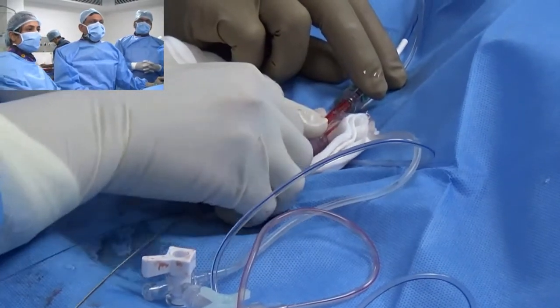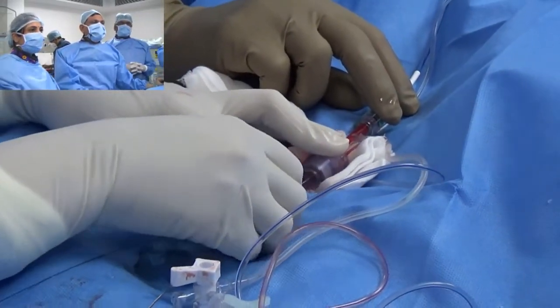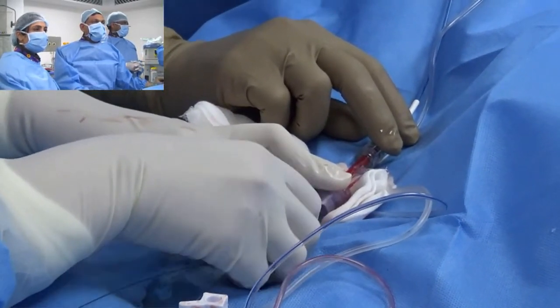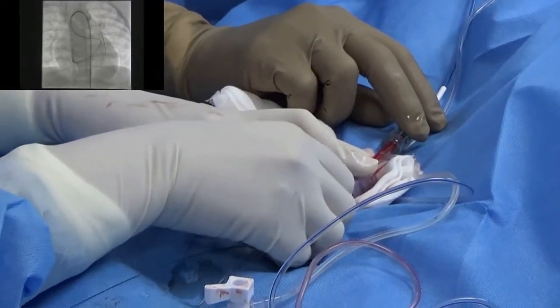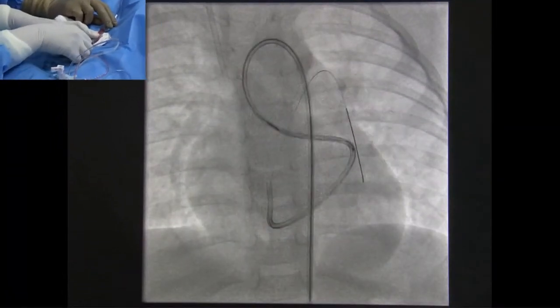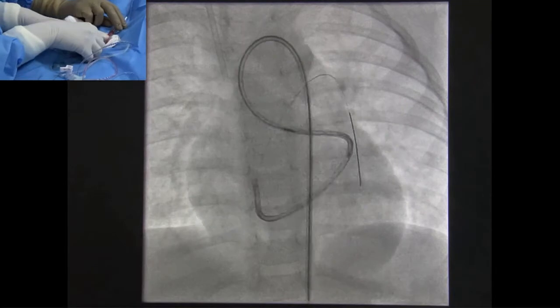So can you show the lateral angio also? Please go. Please show the angiogram. We are only seeing the groin. Okay. Please show the angio. Now we can see live. Don't worry. You can see live.